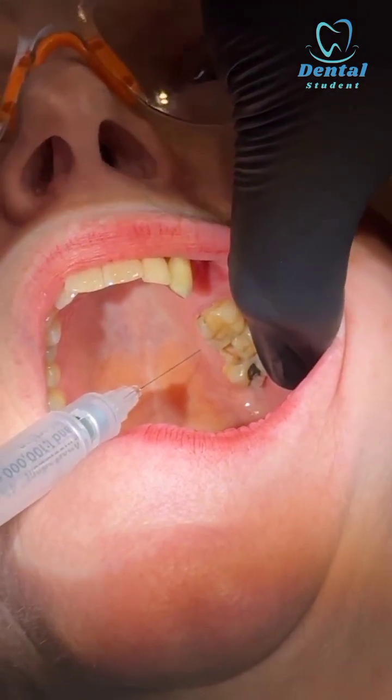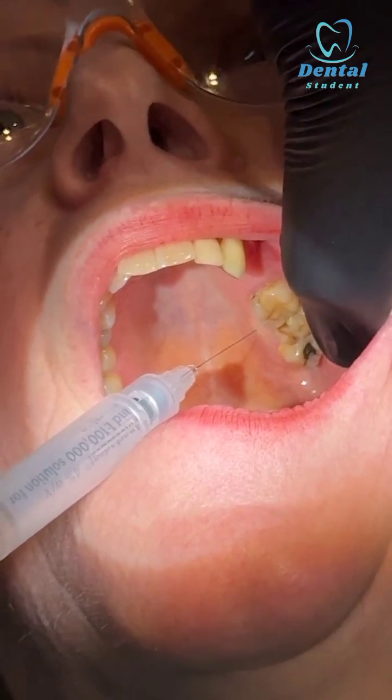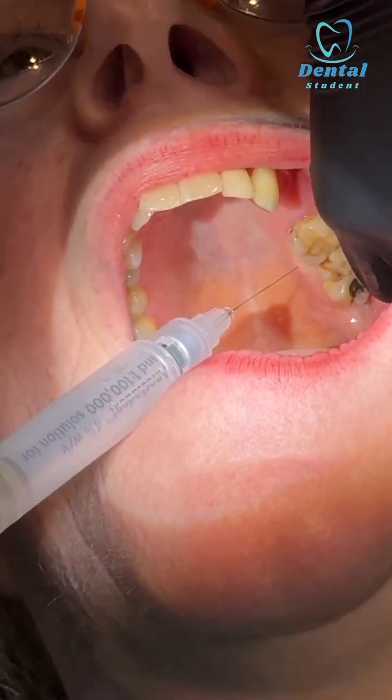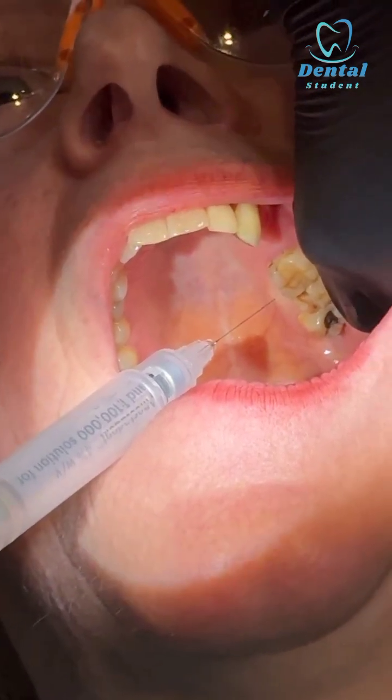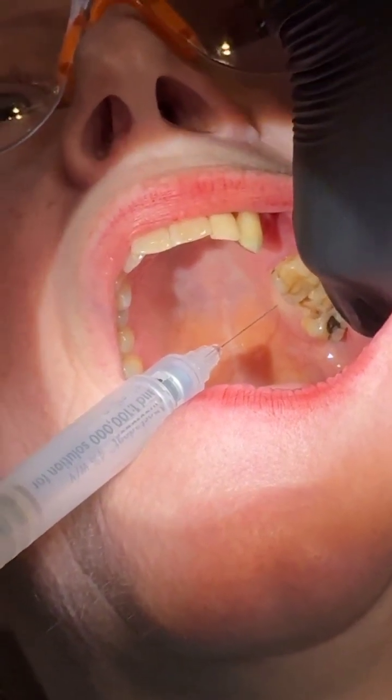We can see blanching of the mucosa — do you know why? And that's all you need: the greater palatine nerve and the posterior superior alveolar nerve.